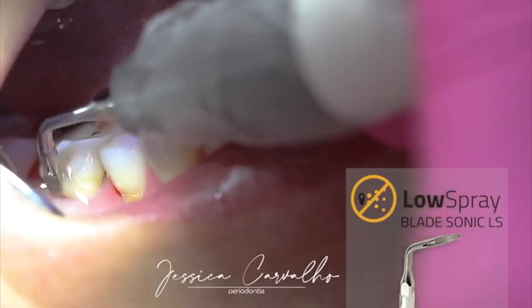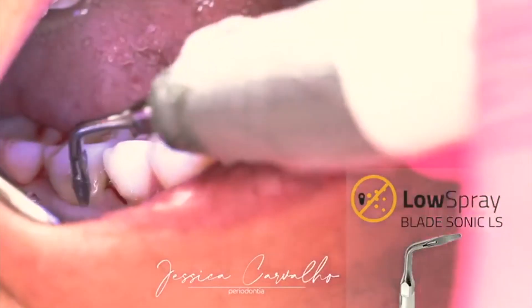My question is about the tip of the instrument — would I be able to access a five to six millimeter pocket comfortably for my patients? So the low spray line has three tips: LS1, LS2, and LS3. The LS1 is for shallow pockets, but LS2 and LS3 can easily treat five to six millimeter pockets. The nice thing about those tips is their shape — they are very thin blades that can go easily into subgingival areas. Feedback from professionals is how gentle they are, so even sensitive patients who usually require anesthetic are being treated without any anesthetics and without pain.